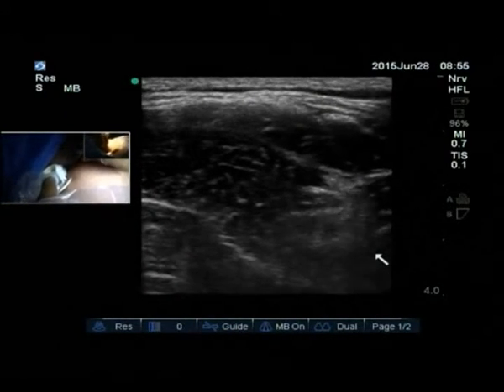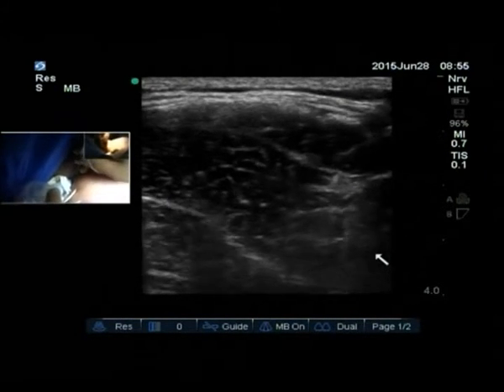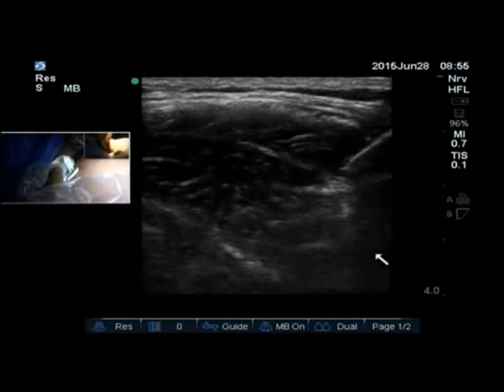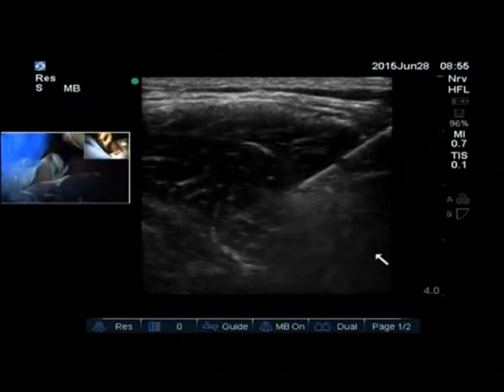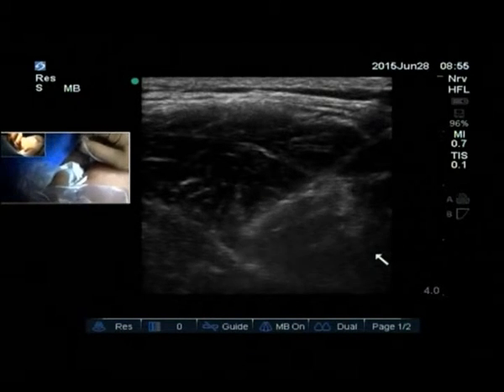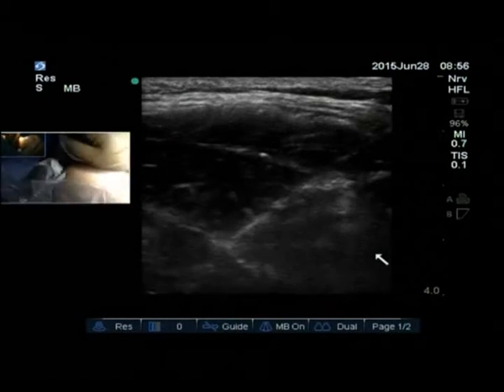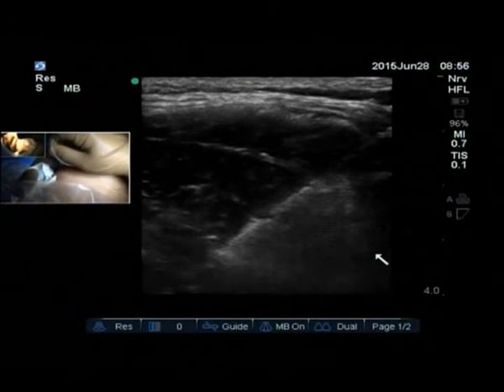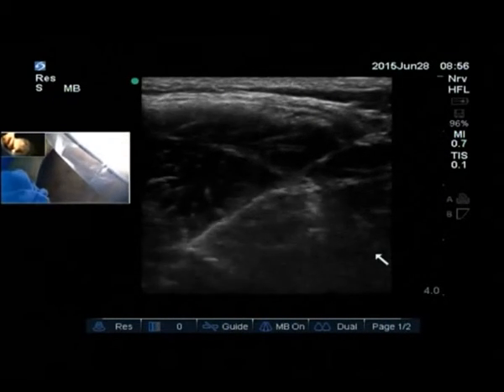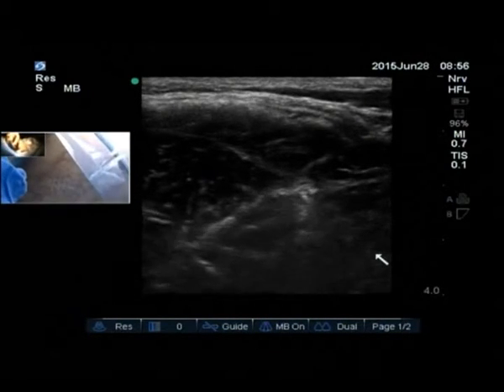The obturator block is very useful when you do a TURBT, very helpful. Now he's approaching the posterior branch, which lies between these two muscles. Almost there, I think near it. The twitching in the fascial line, yeah, now there's the twitching. Okay, you can decrease the twitch, and then we'll inject some local there.